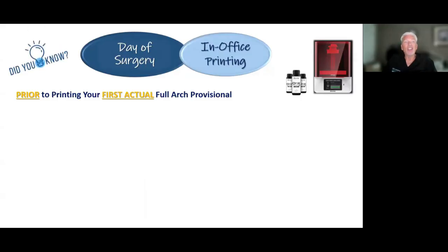So again, prior to doing this, your first case, even if you're printing surgical guides, you're printing temporaries, great, you know how to print. It's a little different when you get into provisionals. You're using a different type of material. The materials have really advanced.